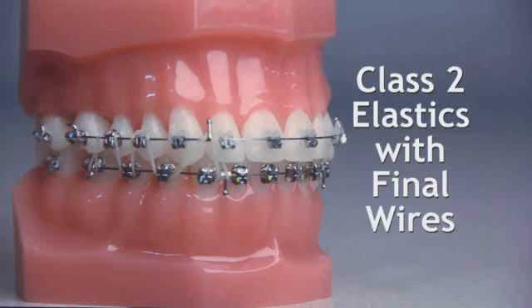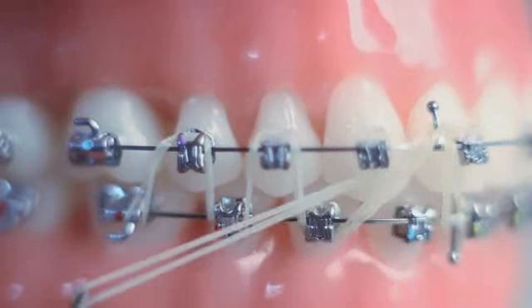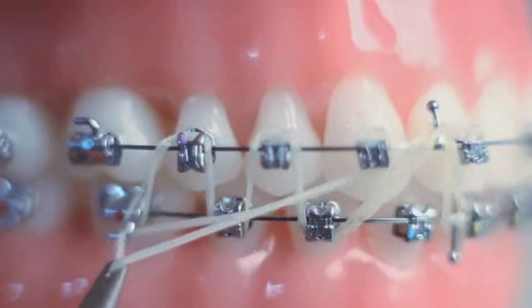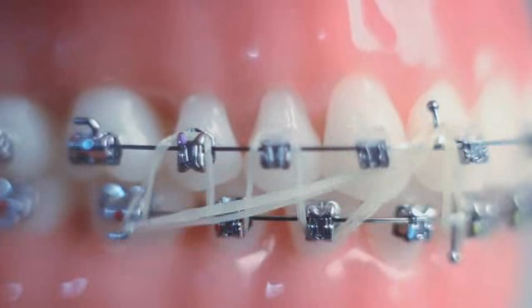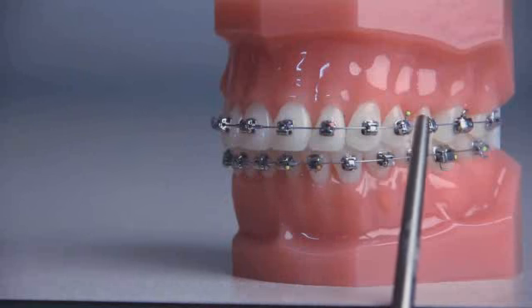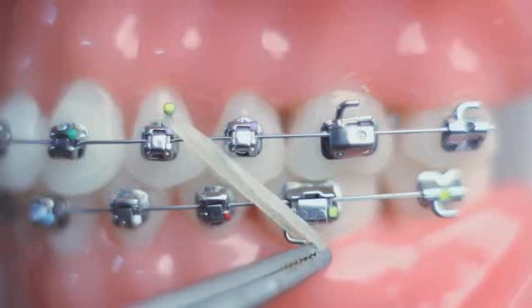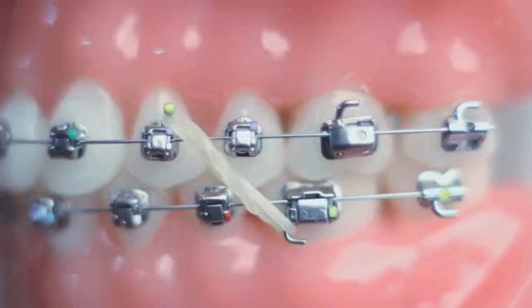For Class 2 elastics, if your final wires are in, hook the rubber band around the hook attached to the wire on the top and diagonally back to the second to last tooth on the bottom. If your final wires are not in, hook the rubber band around the hook placed in the 4th bracket from the center tooth on top, then diagonally back to the second to last tooth on bottom.